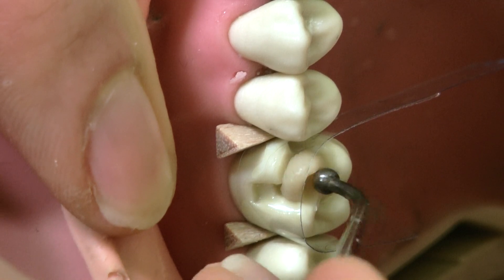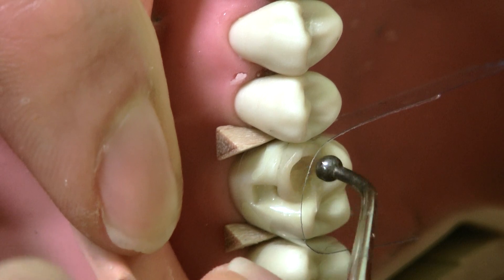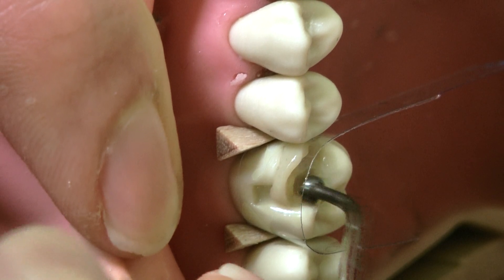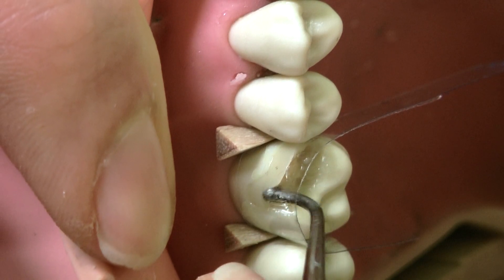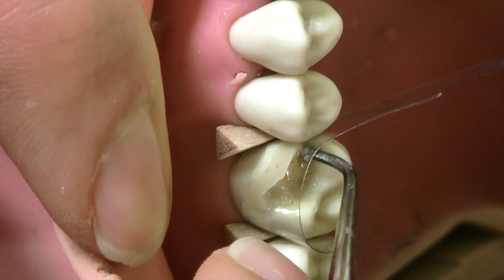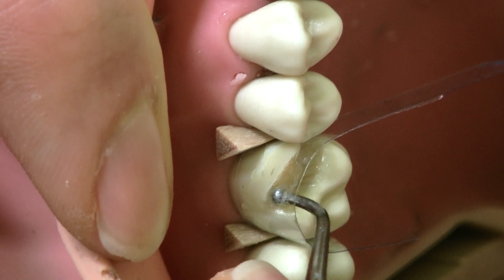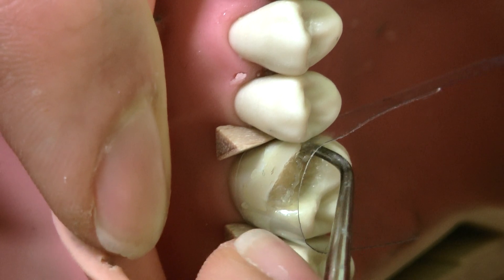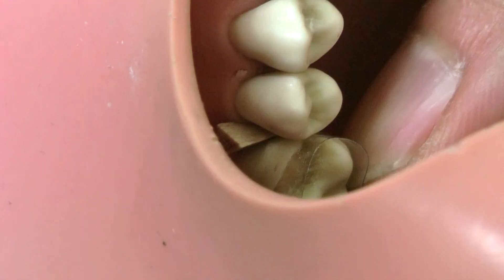We're applying composite. I like to use a ball burnisher to pack it — if you don't want your burnisher to stick to the composite, you can dip it into bonding. Pack it nicely over the cavity and bevel — the buccal and proximal extension boxes — making sure you don't have any gaps or voids. You'll get some excess on the buccal or occlusal, which is fine, but you should not have any excess in the interproximal. To avoid that, before you cure it, hold the mesial, wrap the mylar strip tightly around the tooth, and then cure for about 20 seconds. We do composite in layers and increments to reduce shrinkage and sensitivity afterward.